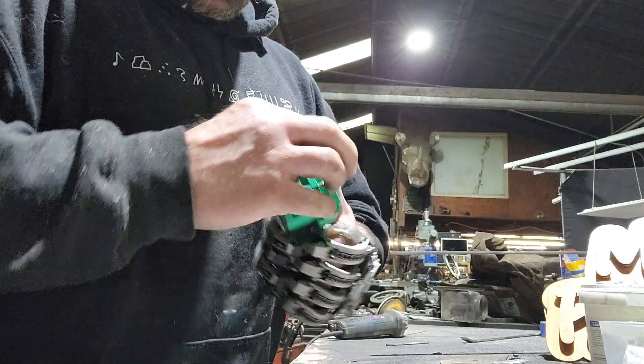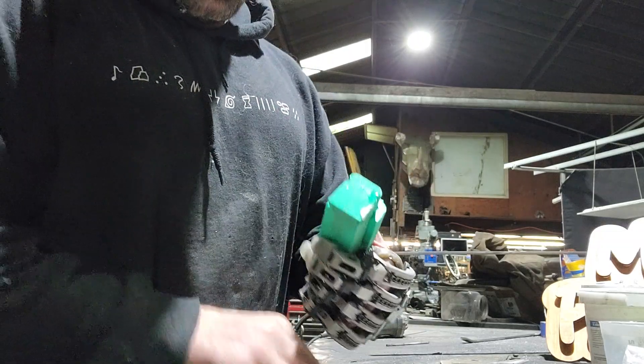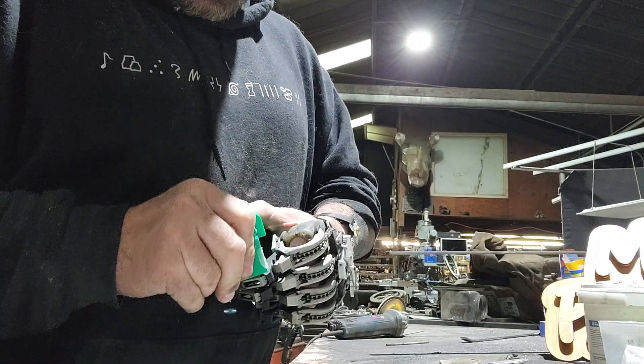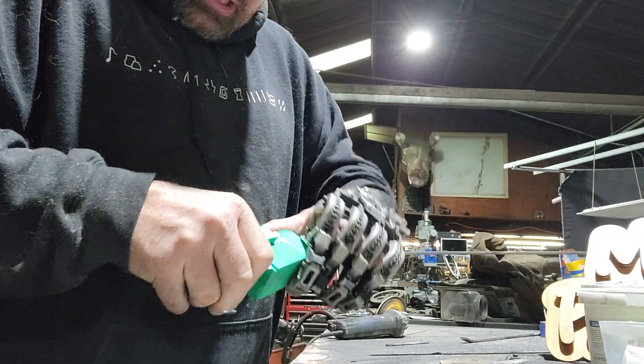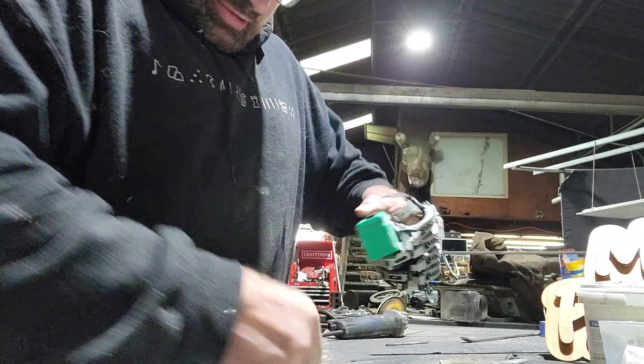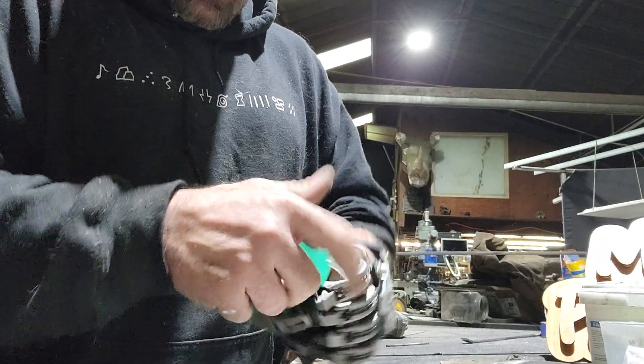Then you pull off the end clamp and slide off the top clamp — that one's going to be kind of stuck because you have the silicone from the front and the back. Go ahead and peel off all the rest of it.